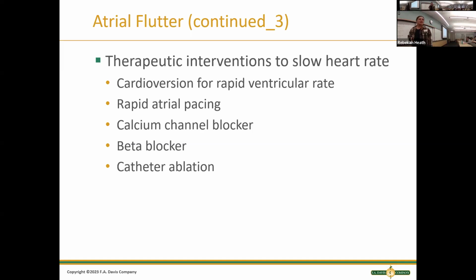If it's an emergency, we will give medicine to help relax them for pain, because it hurts. When you take these patches off of patients, oftentimes the skin underneath is like a sunburn. It's irritated, it's reddened, it hurts a little bit because of that electrical current that goes through. So if we can give them medicine to help relax them and help with some pain beforehand, like with my dad, we absolutely will. But if my dad was passing out, we don't have time to go get this medicine, he's really not feeling well, we'll go ahead and cardiovert without giving medicine.